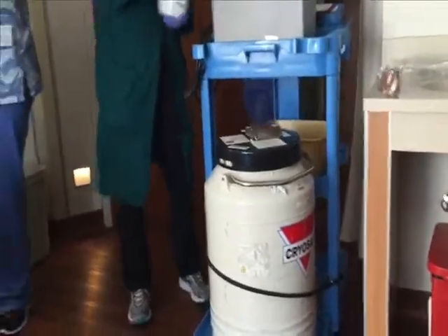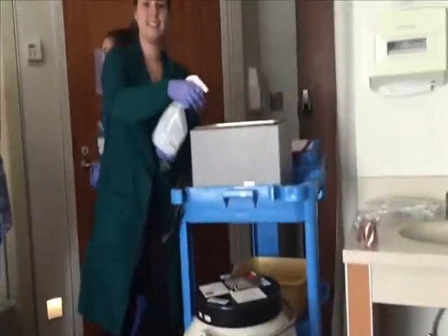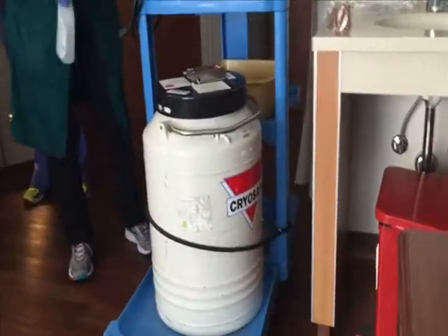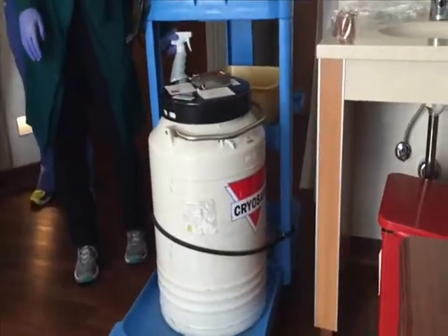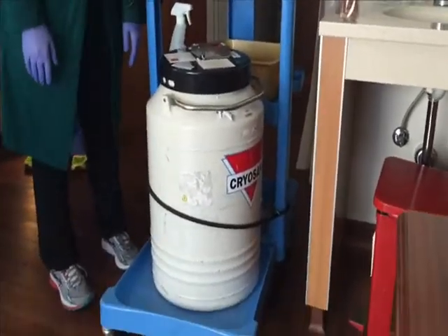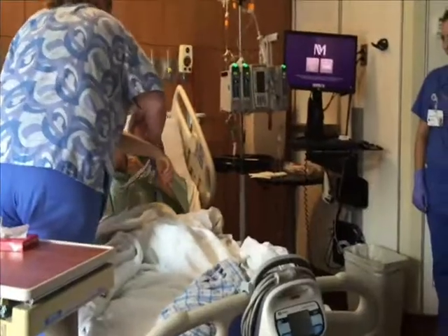Cells have arrived. You got them in the. You don't mind me filming, do you? No. Good. It's called a dry shipper. We fill it with liquid nitrogen, and it absorbs into the walls, and it's at like negative 300 Fahrenheit.